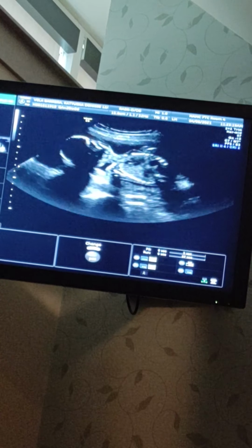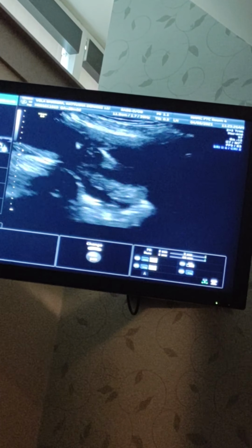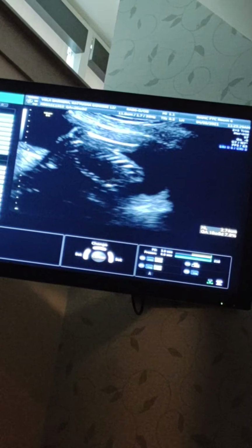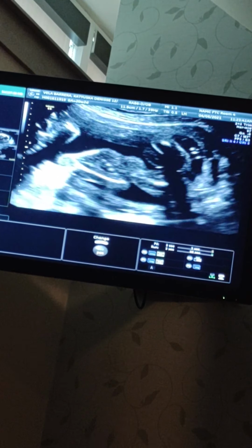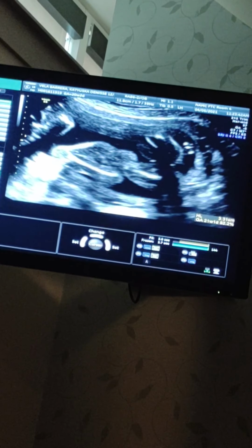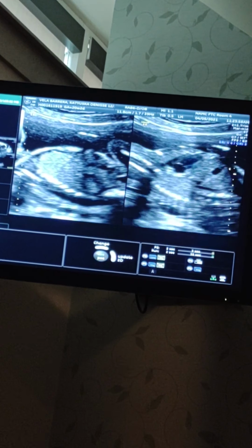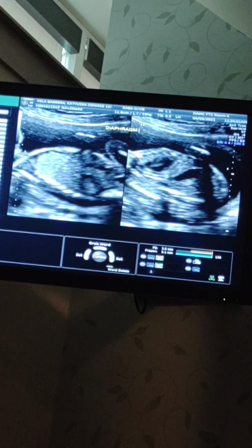Let's measure baby's upper arms now. We saw the forearms and the hands, but we really need to do the upper arms. Right there's one. Humerus bone, that is, from the shoulder to the elbow. Let's get to our other side. Here, there it is. Okay, let's look at the diaphragm here. Here's one side. And here comes the other side. All intact, looks to be.